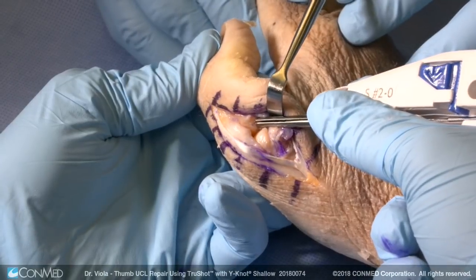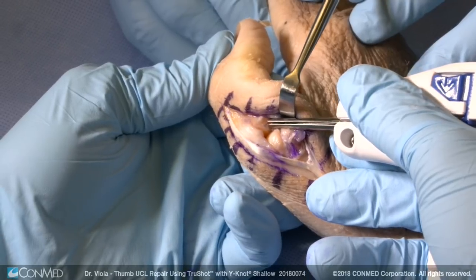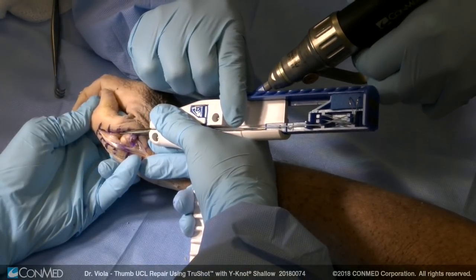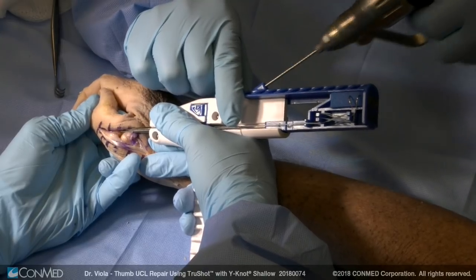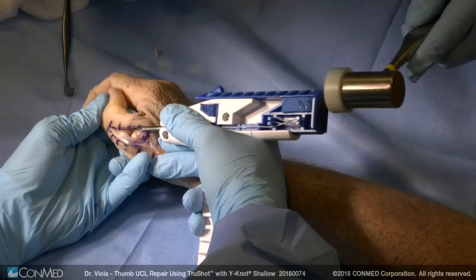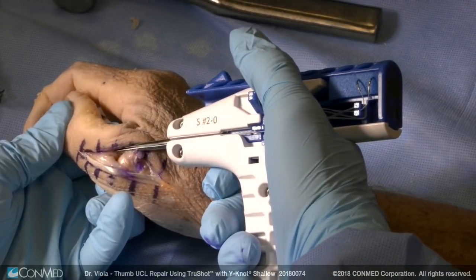So I will take my TrueShot. The end of the guide is serrated so it locks into the bone. We're going to first drill with the 1-7 drill, then remove the drill guide wire and simply deploy the device by tapping it in. When the blue end of the device is seated against the white frame, that means the device is fully seated.